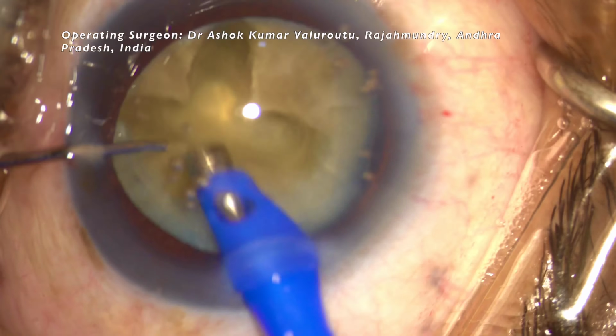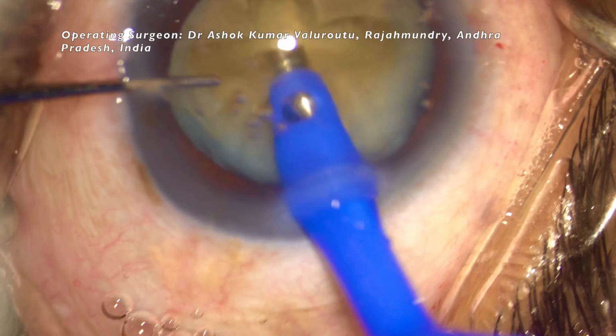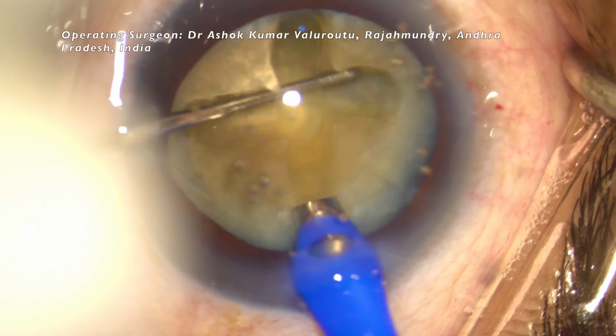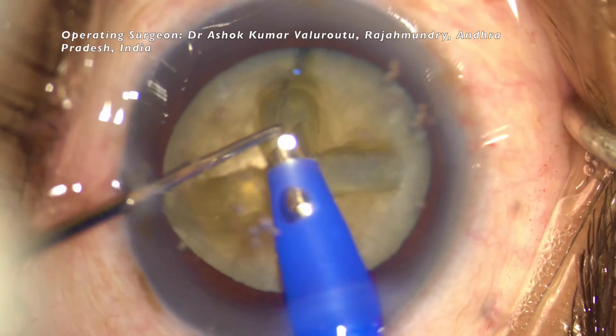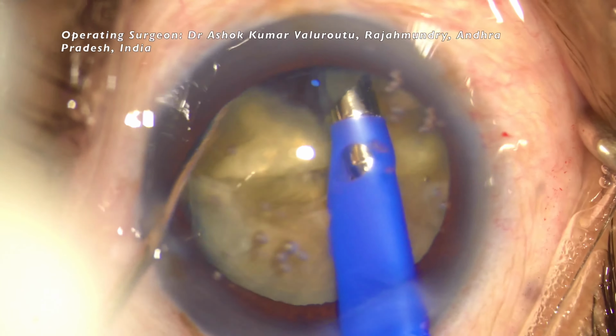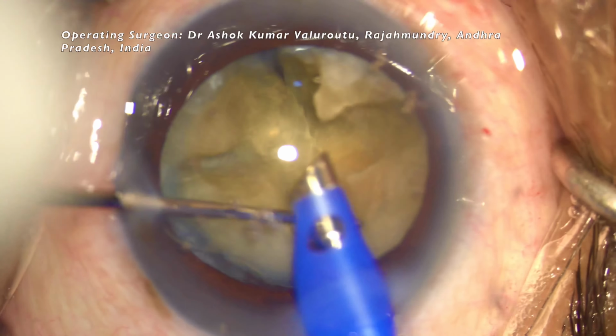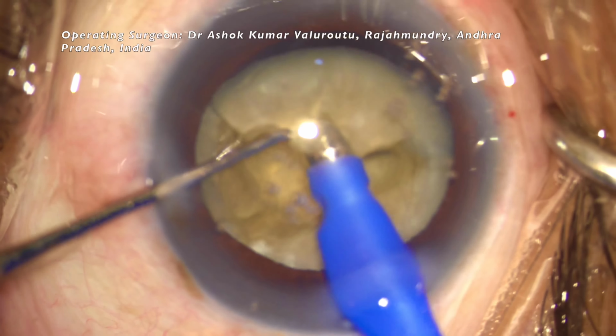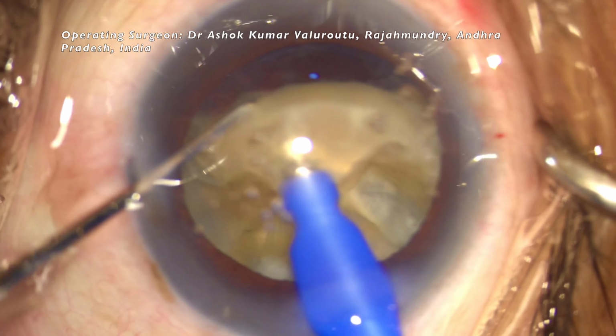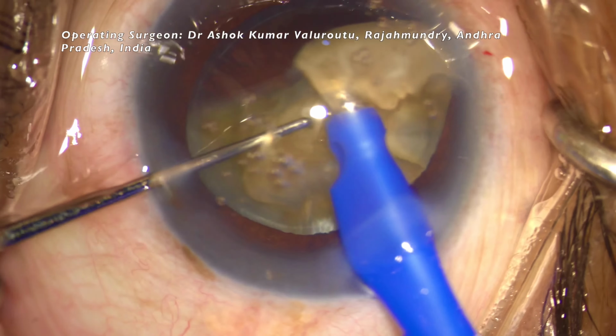Here the phaco energy should be used liberally, taking care of wound burn and the probability of development of bubbles. You could see the quadrants are easily dividable. It shows that the posterior plate has been easily trenched.